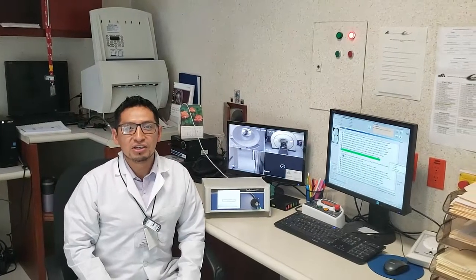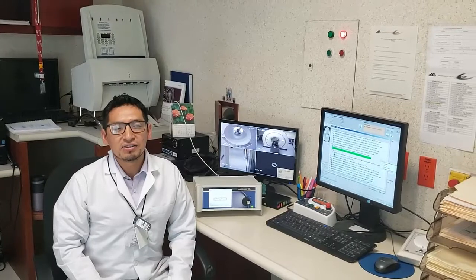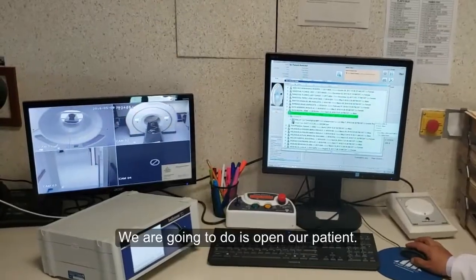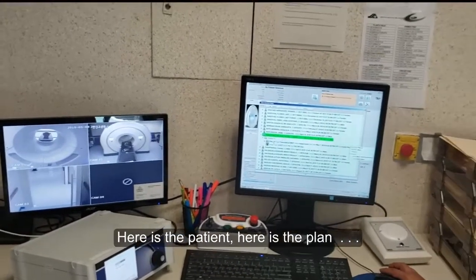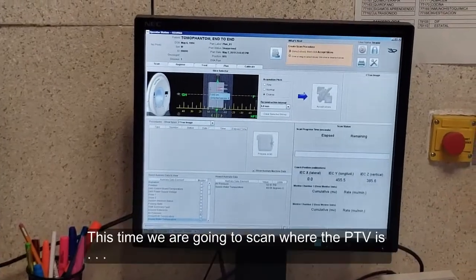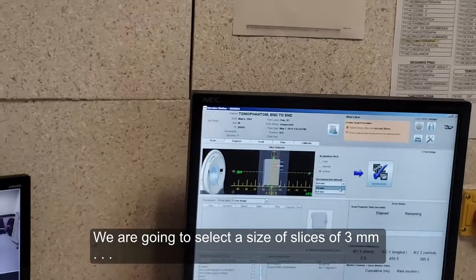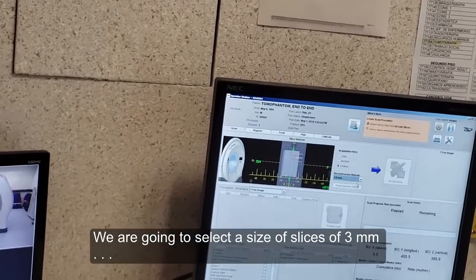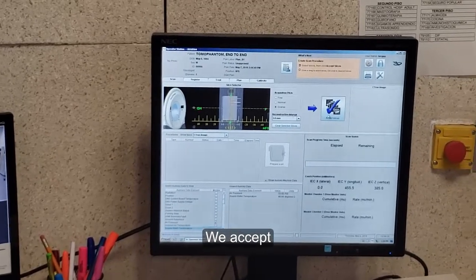Now we are in the operating station of tomotherapy. We are going to review the last two processes: image registration and delivery treatment. We open our patient's plan and say OK. We are going to scan where our PTV is located — we select the size of 3 millimeters and accept.